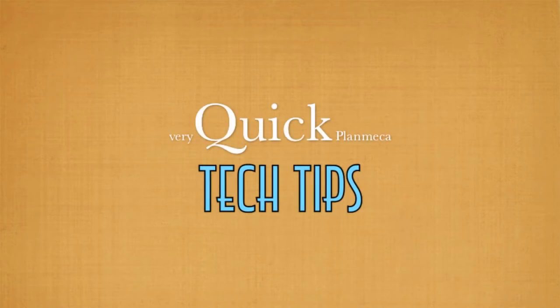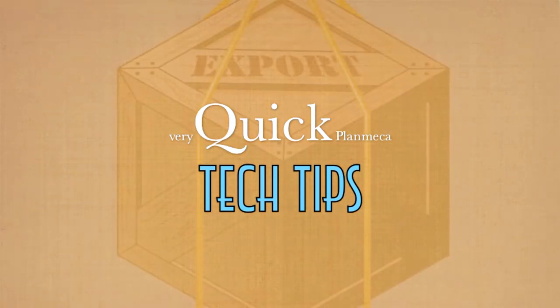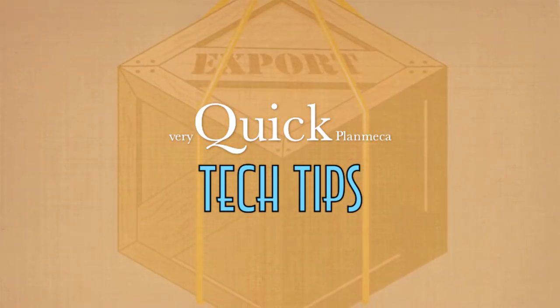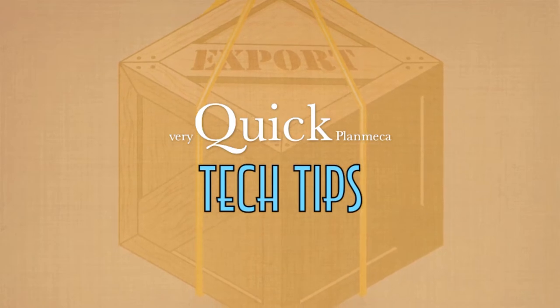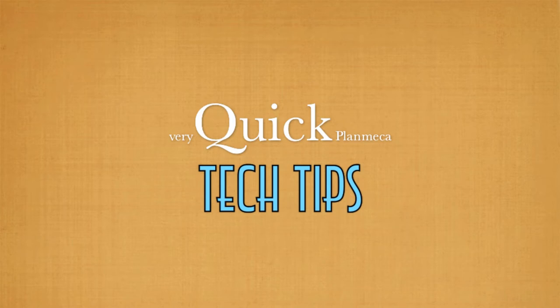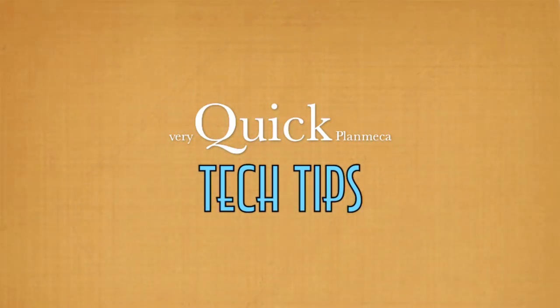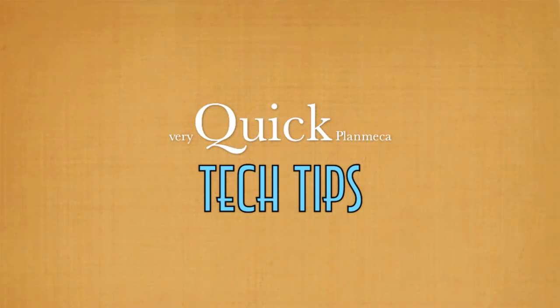Hello, this is Cody Ray with another Planmeca tech tip. Today we're talking about exporting files out of Romexis. It's great that you have access to all that information in the office, but sometimes having that data in the office is not enough. We want to share those images with colleagues or give patients images to take home on a thumb drive or disk, and that's what I'm going to show you how to do today.